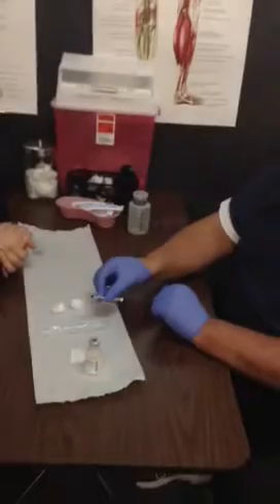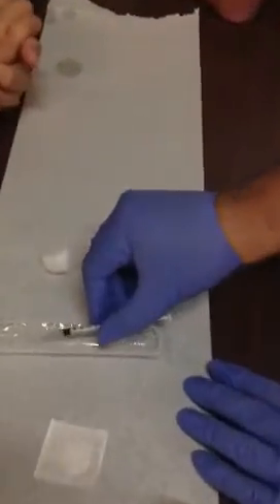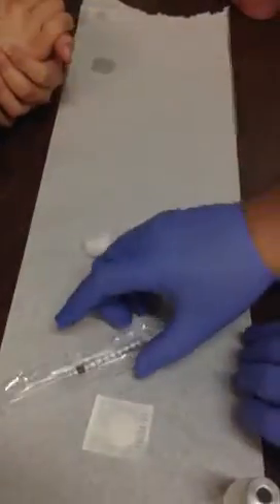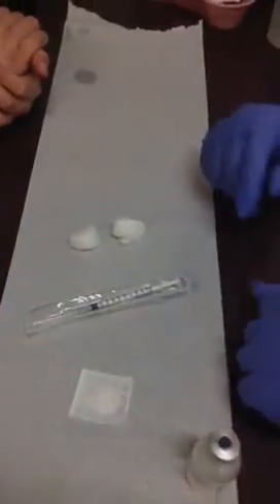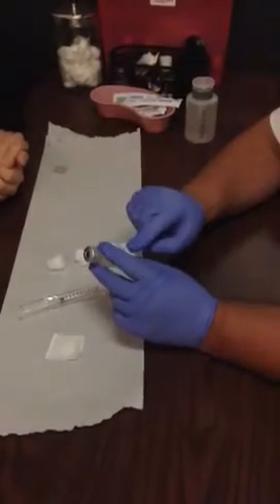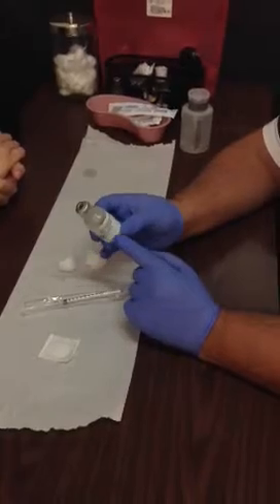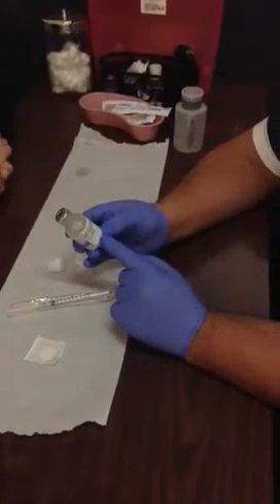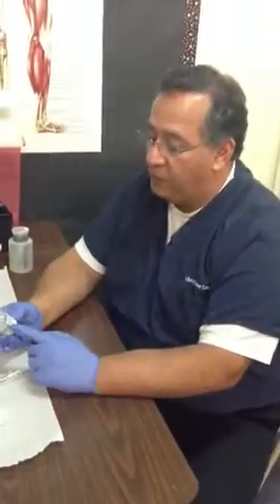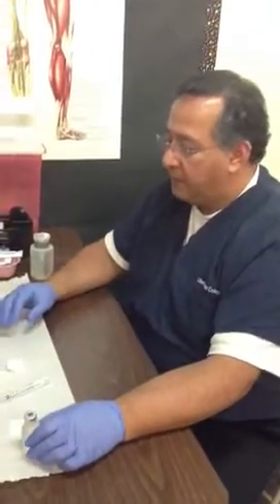Place the needle back into the cap, making sure the needle doesn't touch anything other than the inside of that cap — we don't want to contaminate the needle going into the patient's arm. If it becomes contaminated, stop the procedure and withdraw again. Now do our third label check — make sure the label still indicates the right medication, it's not expired, and read all the important information. It's very easy to pull the wrong medication off the shelf, so always verify.